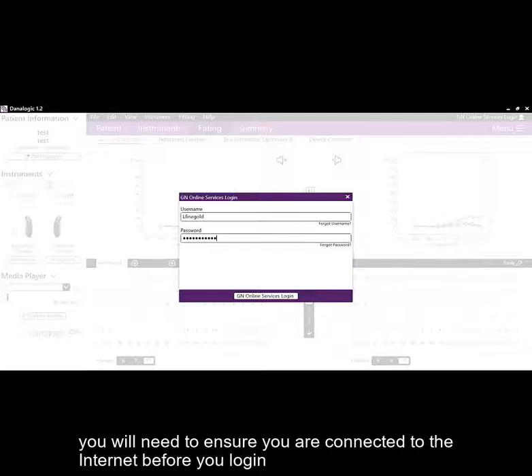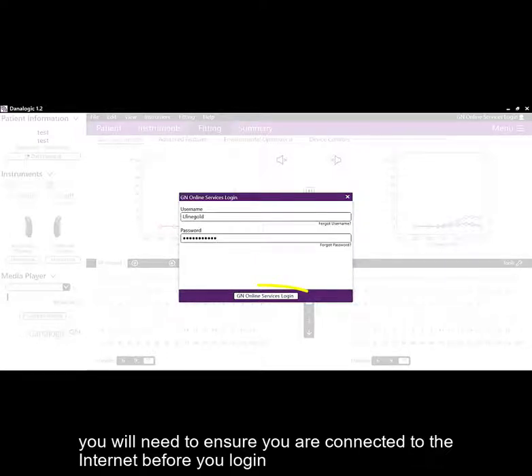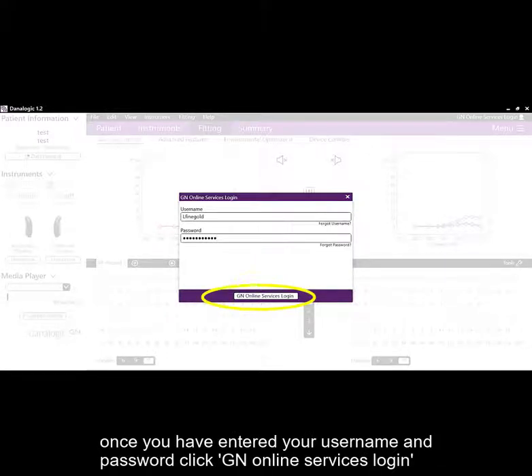You will need to ensure you are connected to the internet before you log in. Once you have entered your username and password, click GN Online Services Login.